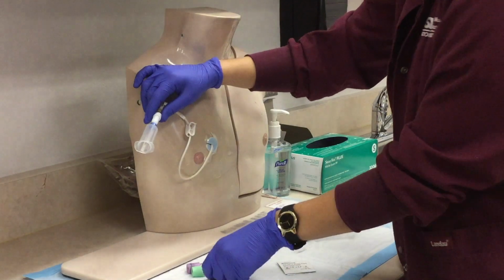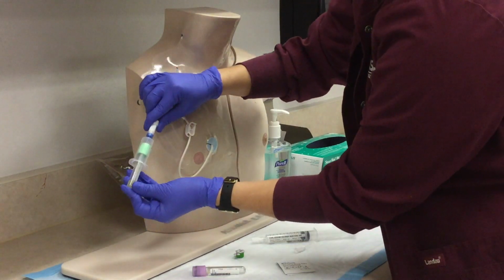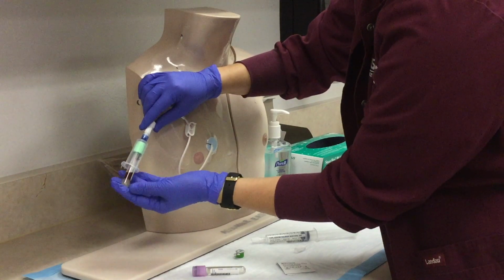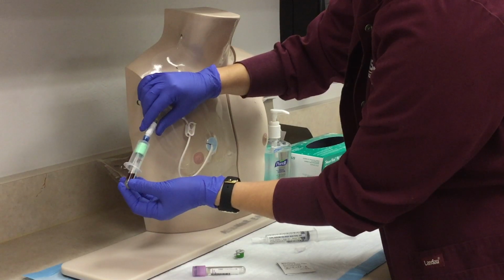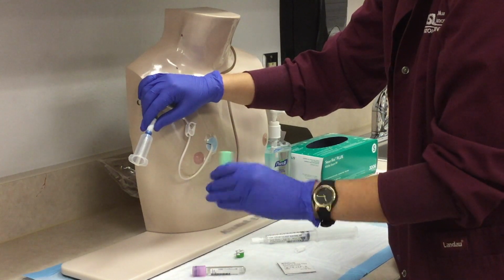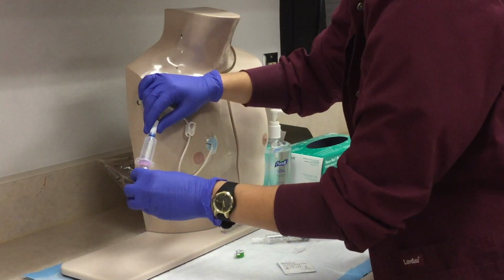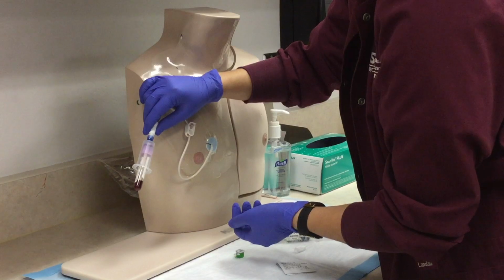Attach the appropriate specimen container to the vacutainer and allow the blood to fill to the pre-specified amount. Do not force the specimen tube, it will fill automatically. The correct order of the tubes for this blood draw is green and then lavender. Gently invert the tube 8 times to mix the blood with the additive in the tube. Do not shake the tube. Repeat these steps as many times as needed to obtain all specimens and reclamp the line when finished.